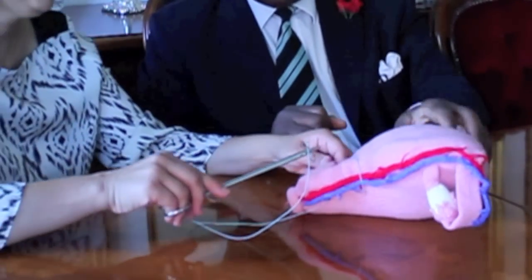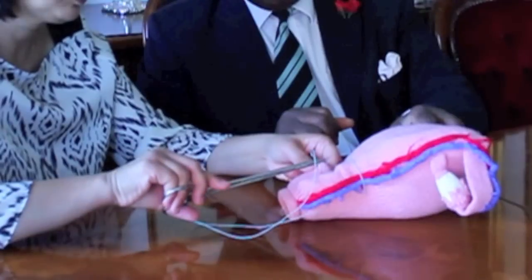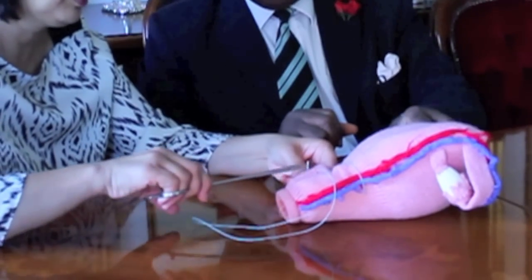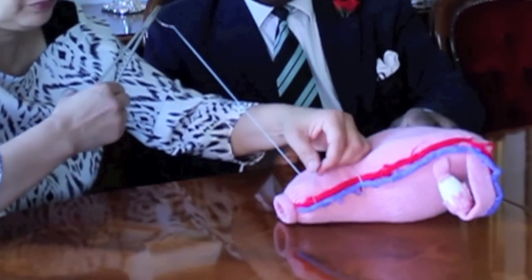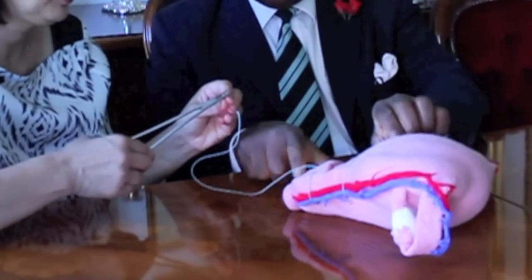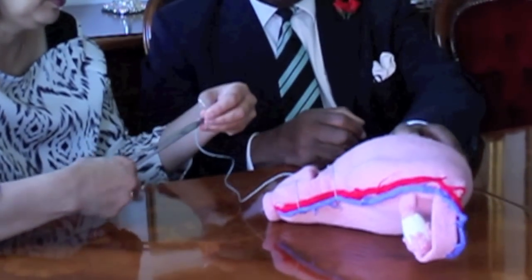Now the assistant picks up 1 cm of tissue across the lower segment to stabilize the suture material so it does not migrate into the cavity of the incision.